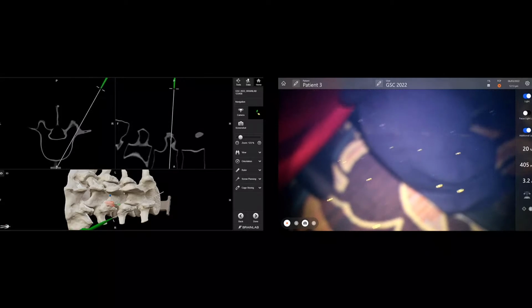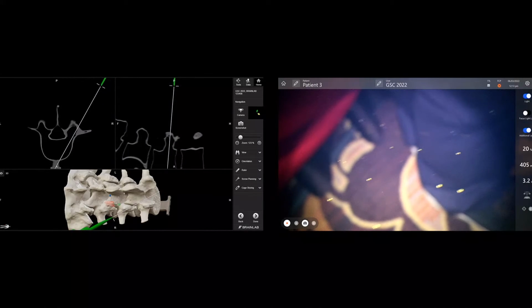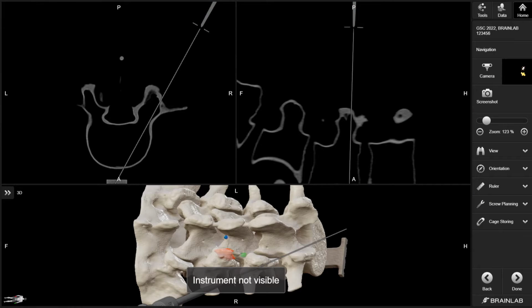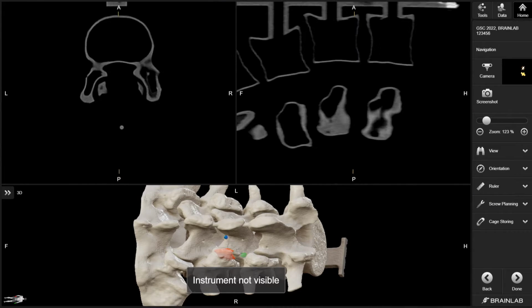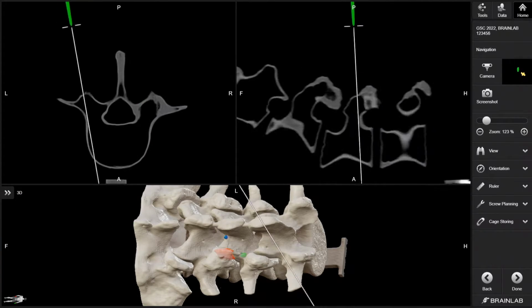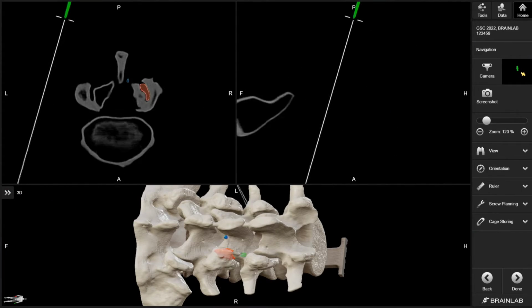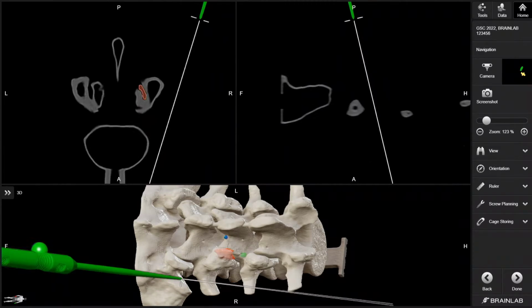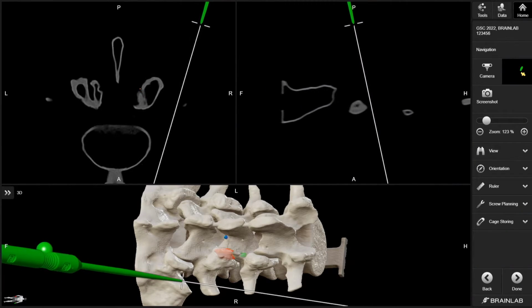And then for the L4 pedicle screw, I would pick this trajectory here. So that's right next to it. Now the skin incision is going, and I would do the same thing on the other side. So at the end we end up with 2 skin incisions. I'm only going to show you the right side. So now, obviously I connect the 2 dots, I make a skin incision.